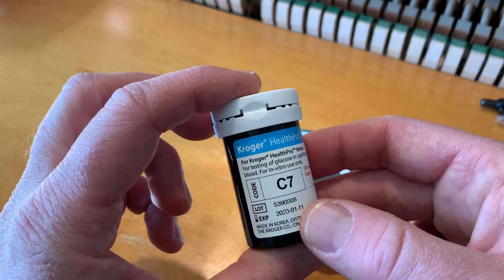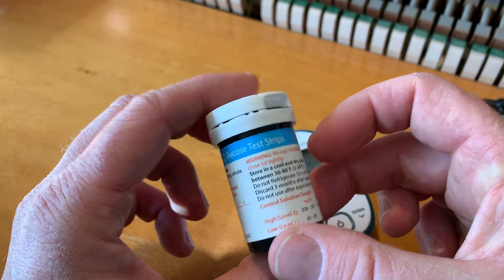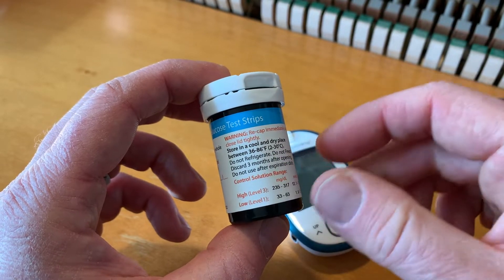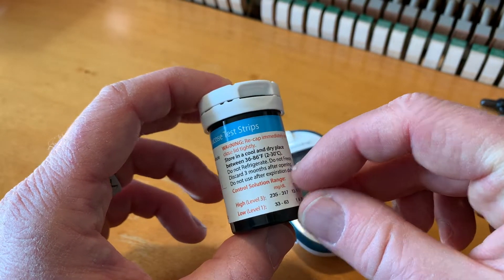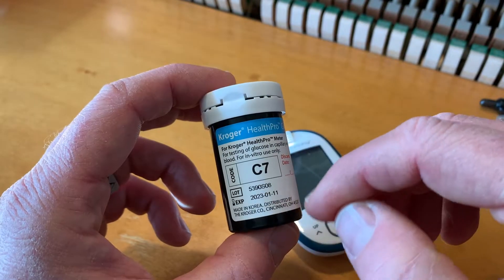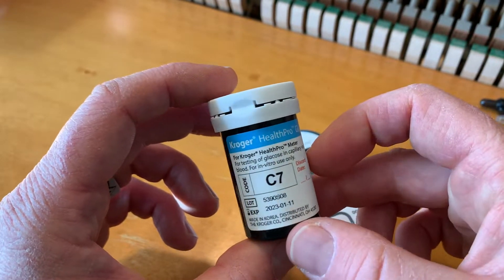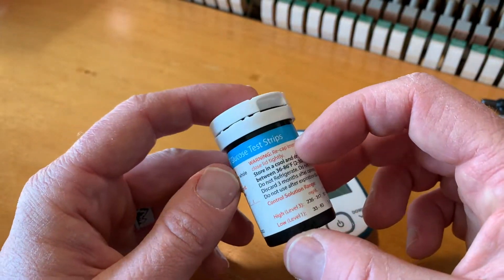I'm using these Kroger Health Pro glucose test strips. You can see they need to be stored in a cool and dry place between 36 and 86 degrees Fahrenheit. It's important to keep these things within their expiration date. Don't use things that are expired because you won't get good healthy readings.